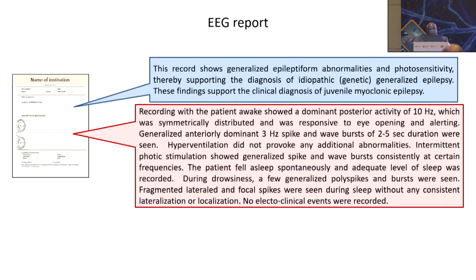So very concisely, I have conveyed everything I have seen through the report. One should give a very brief report. Nobody would have the patience to read a lot of unnecessary things, and even the sentences should be framed in such a way that they convey the information very briefly, concisely, and to the point. And this requires a lot of experience, and you have to be initially mentored.